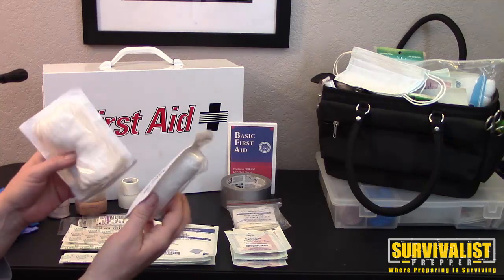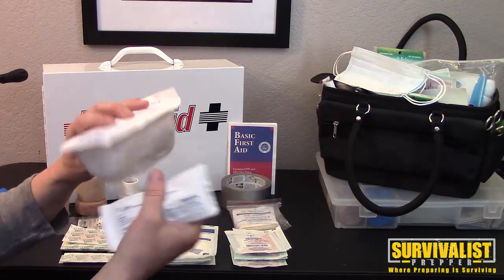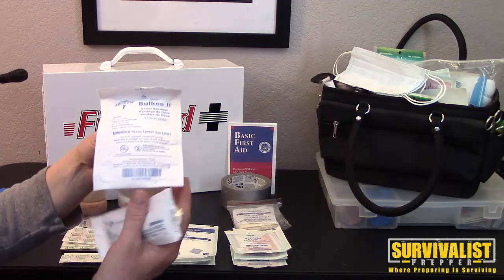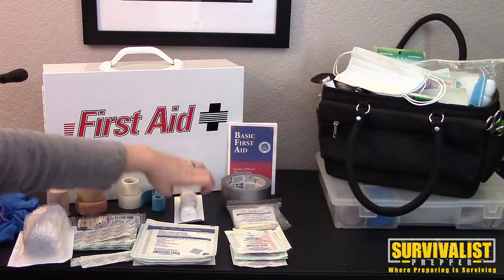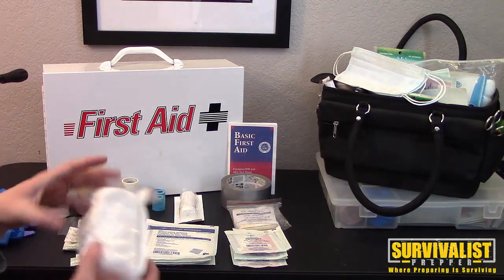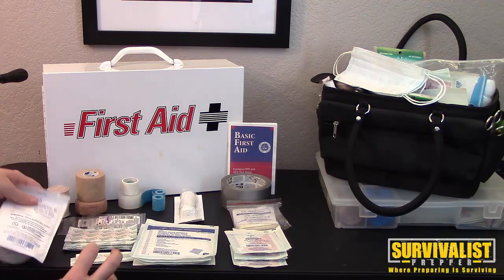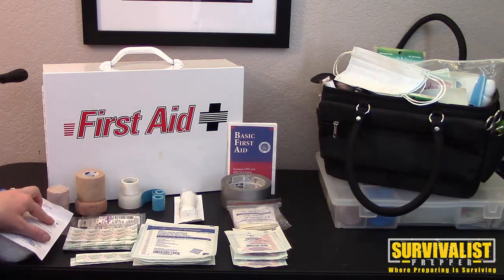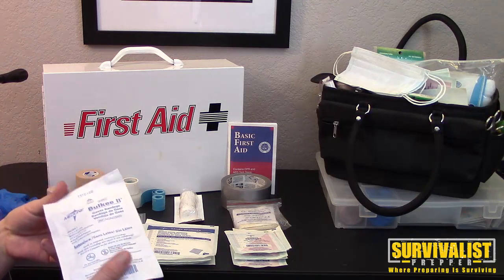Rolled gauze comes in lots of different sizes. This one is a little more stretchy, and this is a bulky gauze that will actually absorb drainage — those are good for packing or wrapping a wound. It just depends on the situation. It can act as a barrier between the skin and an adhesive, depending on the person and the situation.